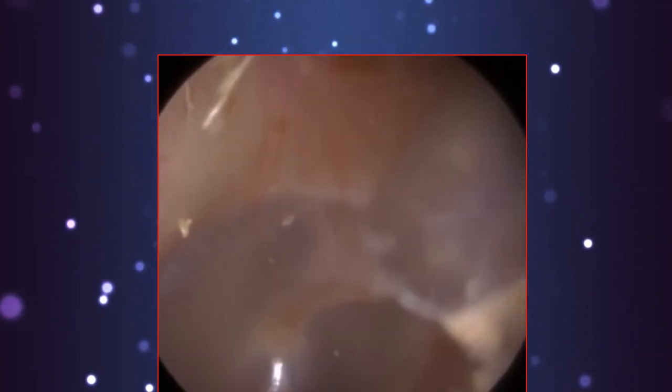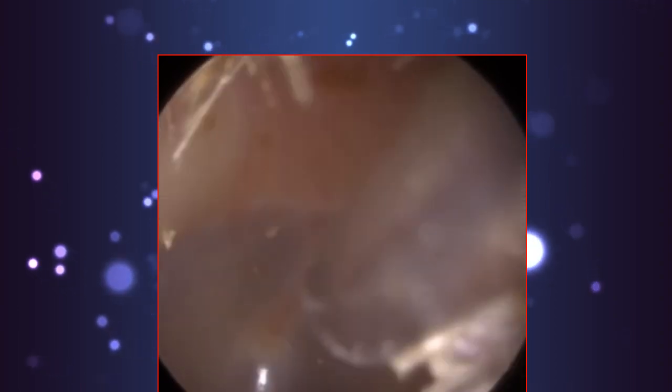But if we're on the inner two-thirds of the ear canal, the bony part, and we start bumping into the canal wall, it can be really, really uncomfortable for the patient. Now, this skin is really thick, it's strongly adhered, so I'm just slowly but surely peeling it away.